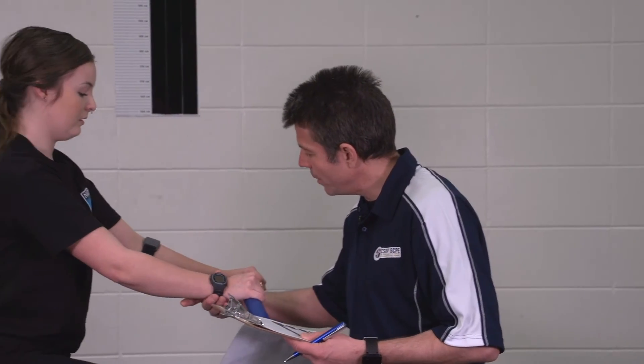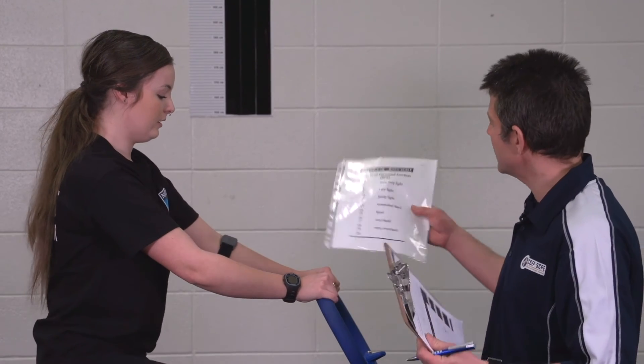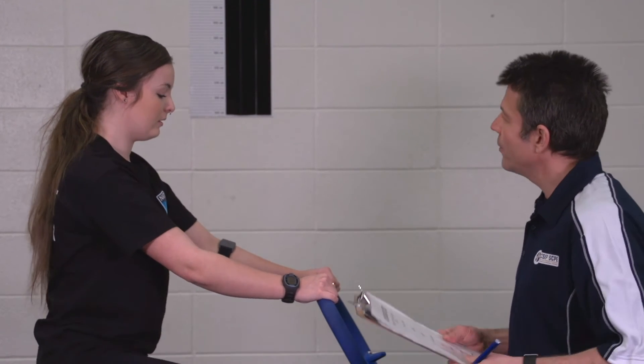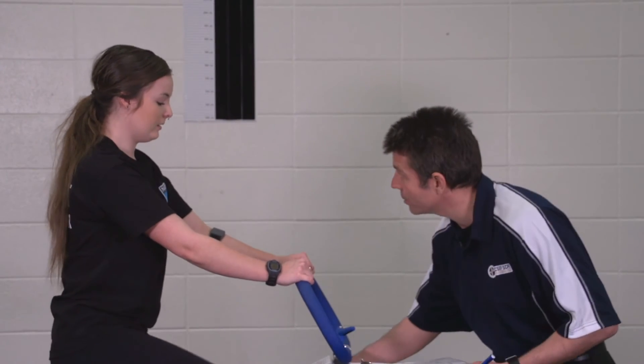Alara, minute four. Okay, so now that's in steady state. How difficult are you working? Sixteen. So your last heart rate was within 10 beats of 85% of your maximum, so we're going to stop the test now. I'm going to let you cool down a little bit, so I'm going to take the resistance off.